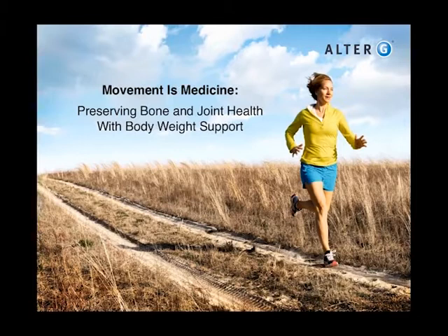I try not to go more than 10% body weight a week, just because I want them to have a chance to adjust. Again, I don't want to cause pain, because if there's pain and inflammation, then we're going to go backwards. So I don't let them increase more than 10%. Say they're pain-free at 60%, and then they're using the AlterG the following week, I let them go up to 70. But if they feel good at 70, I don't let them go up to 80 or 90, just because I don't want to cause inflammation. So I make sure they don't go too fast.